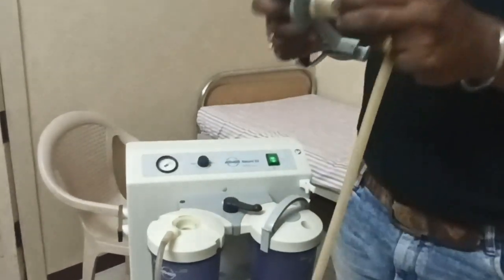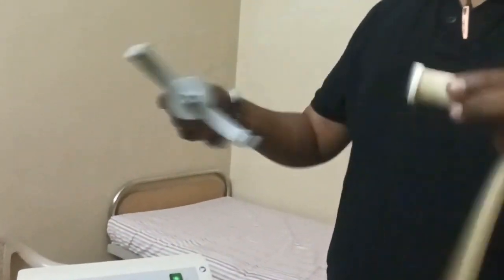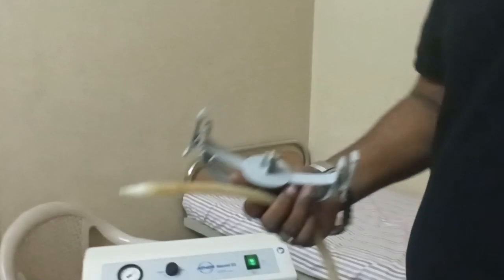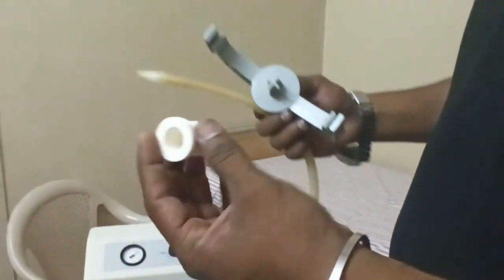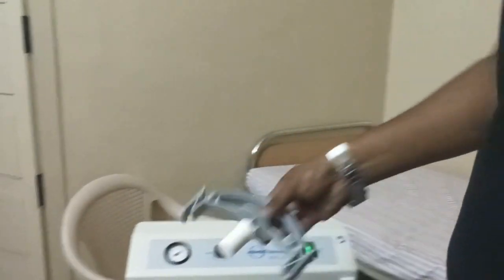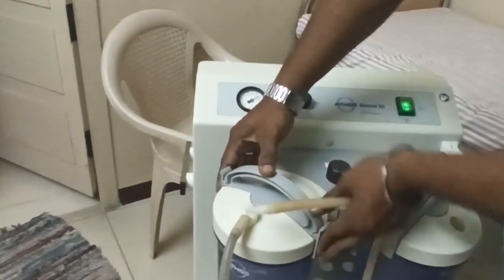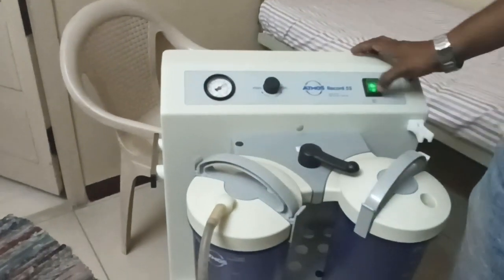Moreover, this is a disposable filter, so we just have to remove it and throw it out. Now I'm going to install a new filter — this is a brand new filter, white in color. I'm connecting it and locking it in place.